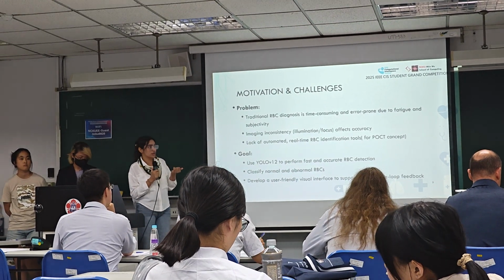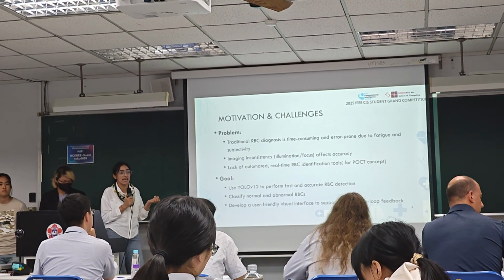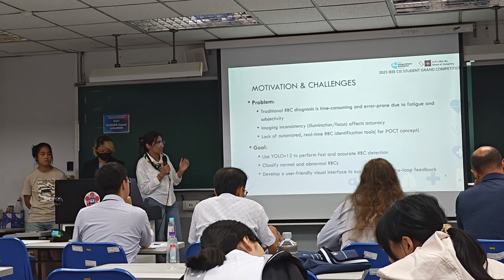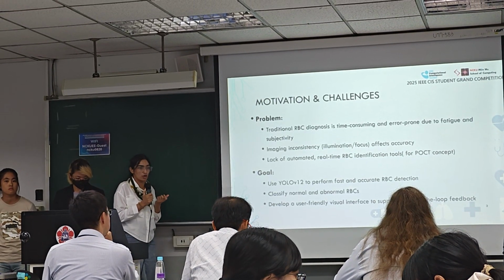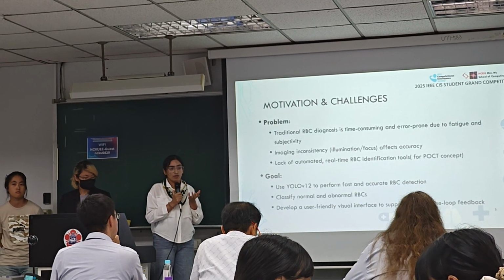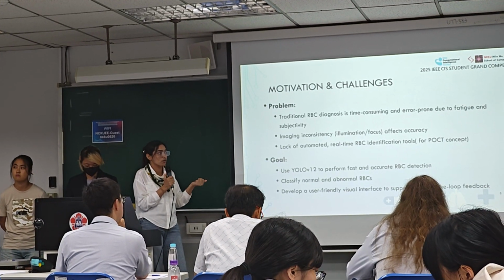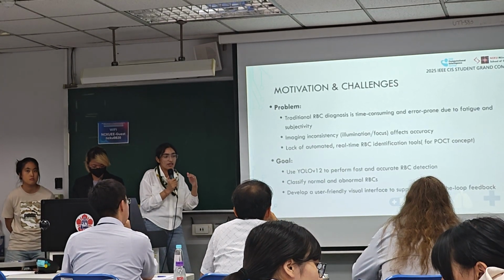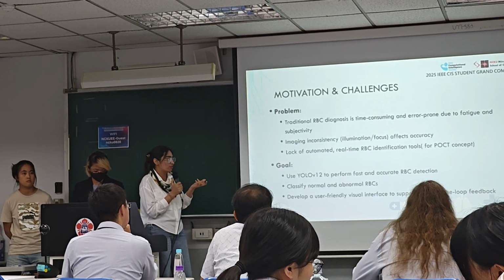It may also have other disadvantages, like a heavy workload of patients, and there are also chances of human error when we are doing the step-by-step process in the laboratories using different automated machines, which take a lot of heavy equipment and machinery. A big factor is also that when we do it manually in the hospital, there are problems while doing microscopic image analysis, such as focus on the image, recognition of the images, and light contrast problems with the microscope.